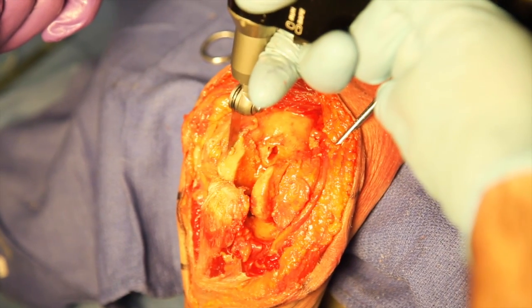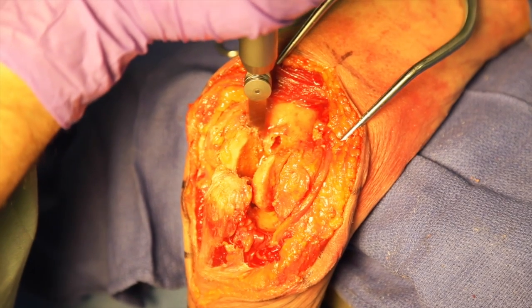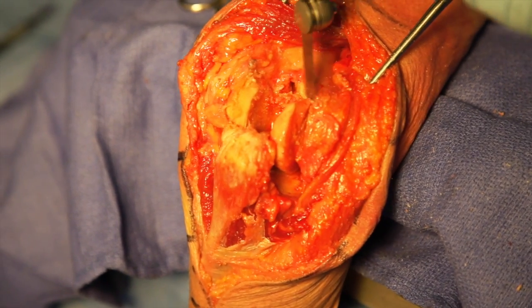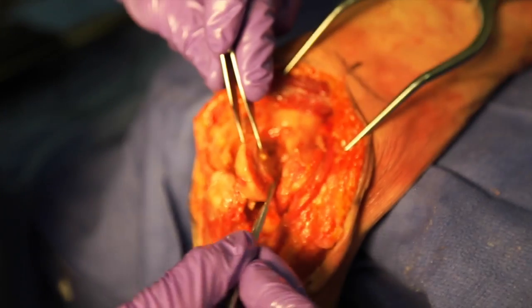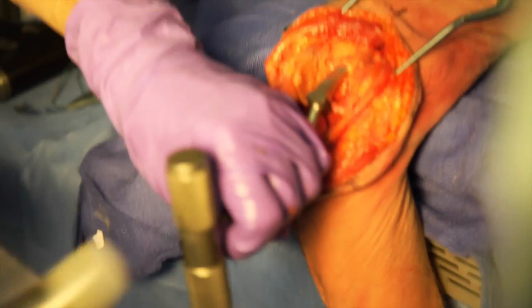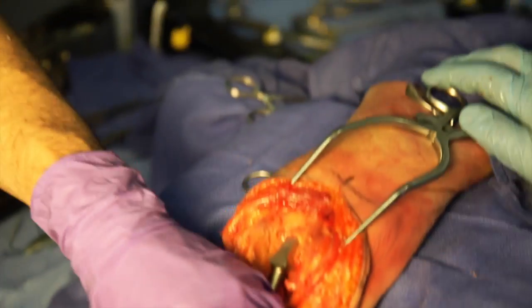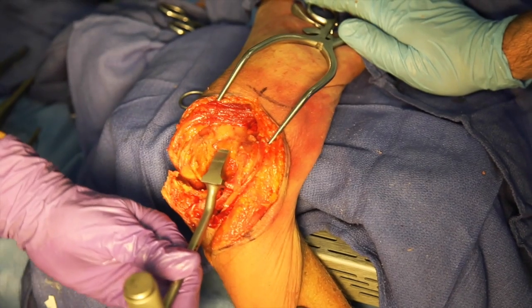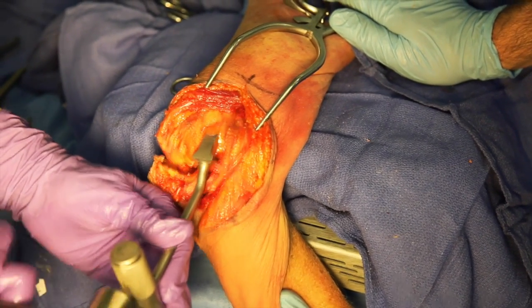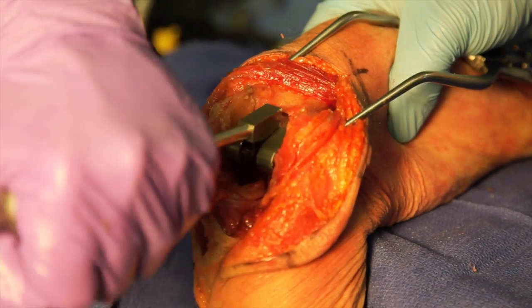The cuts are then completed with the use of an oscillating saw. This bone should be retained for use as bone grafting of the anterior flange. The humeral rasps are then used to open the canal to the correct diameter for the selected humeral component. The humeral trial component is then inserted.